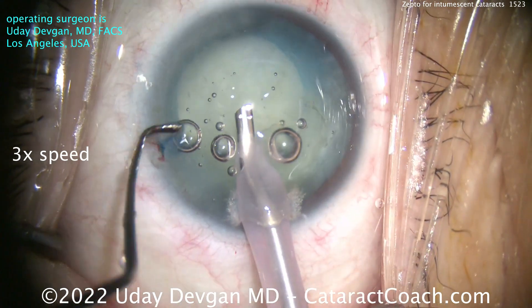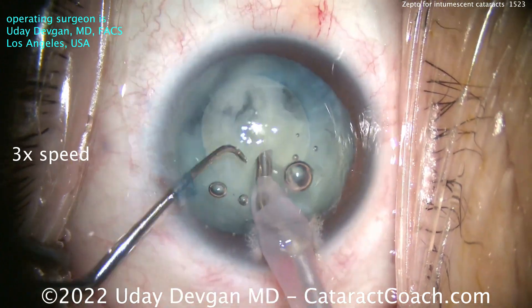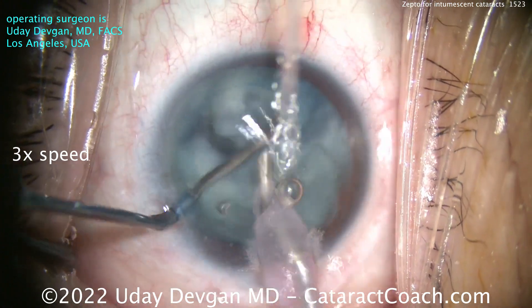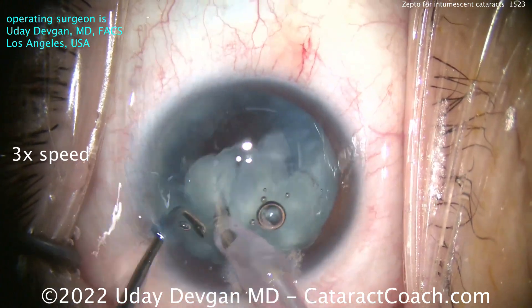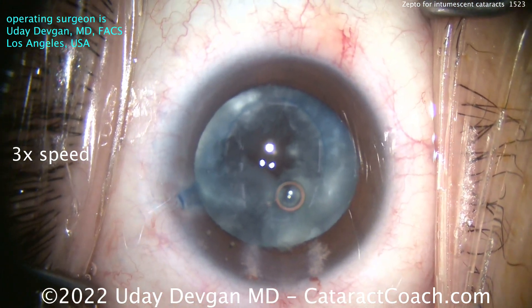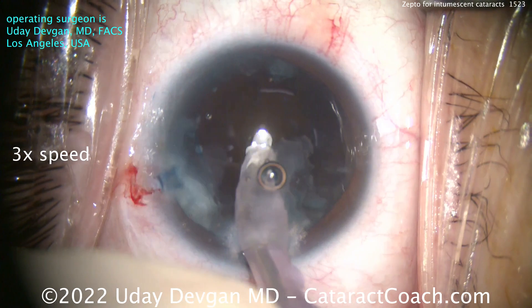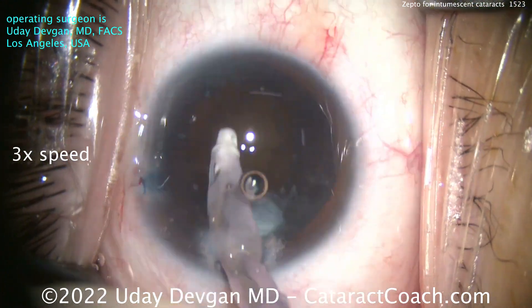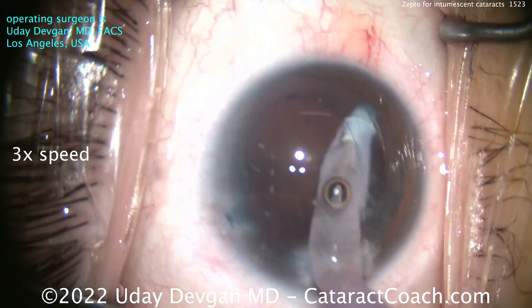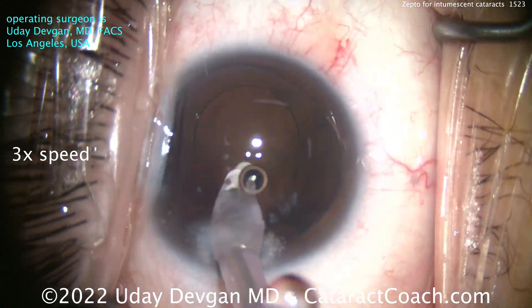Now I'll speed up the cataract part of the video. This is an intumescent cataract, so the lens cortex is liquefied with some good density in the lens nucleus as well. We'll be very cautious removing all that. This capsulotomy is exactly 5.2 millimeters, and the edges are very strong — much stronger than if done with a femtosecond laser. This device essentially eliminates the issue of the Argentinian flag sign, making it a very predictable case and taking away a certain amount of surgical stress.